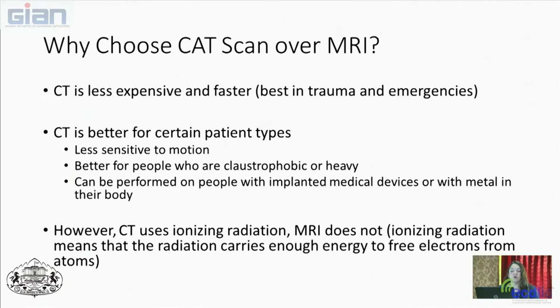MRIs also, since they use this big magnetic field, can be limiting for people with implanted medical devices or with metal in their bodies. So if you have a pacemaker or anything that runs on electromagnetics in your body, you don't want to expose this person to an MRI.